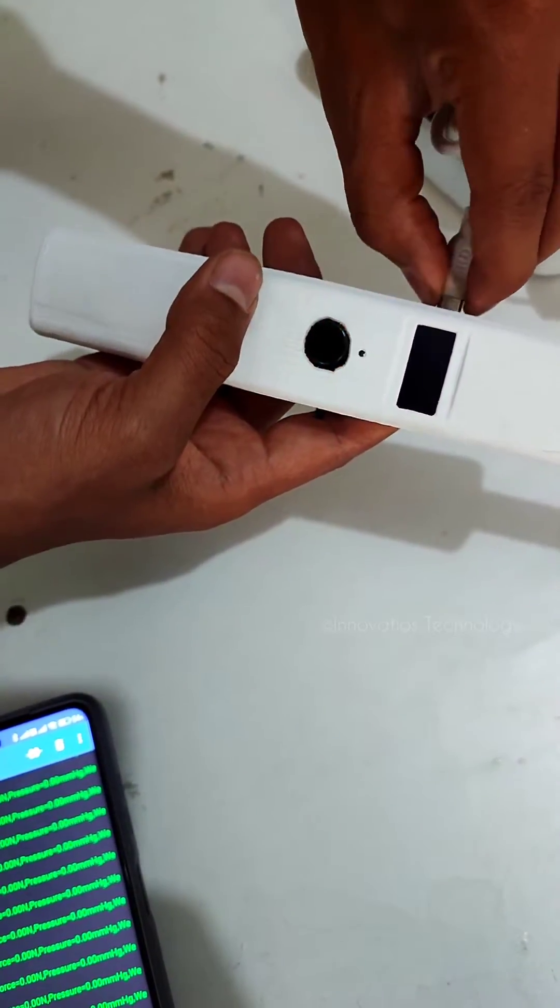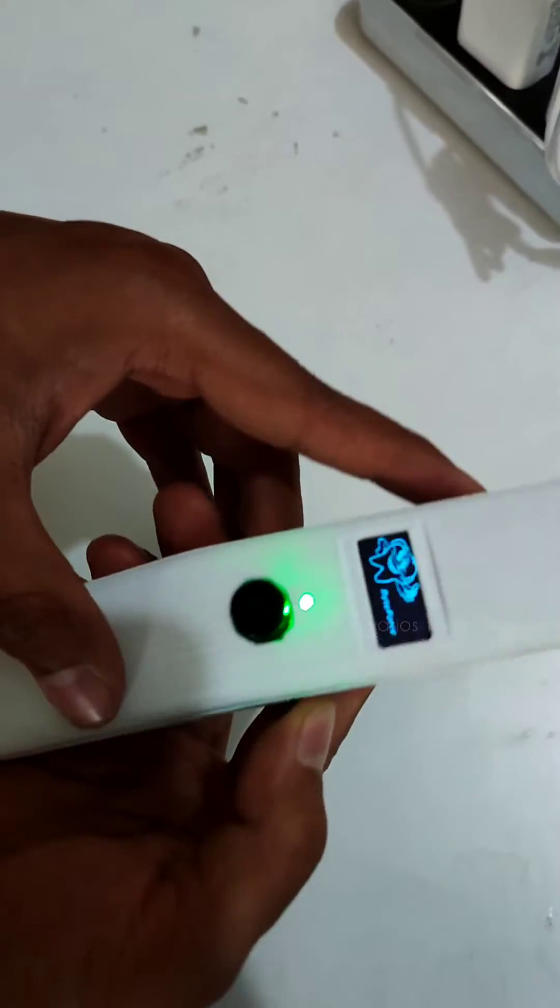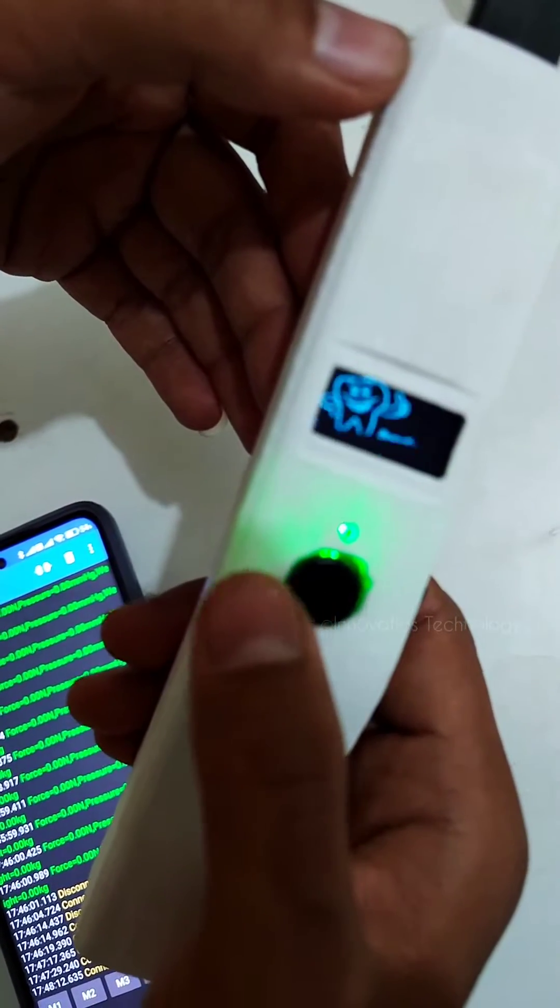The green color LED shows whenever the device is powered on or off. The blue color LED activates whenever you press the button to start operations.